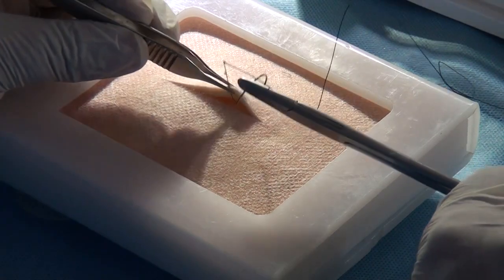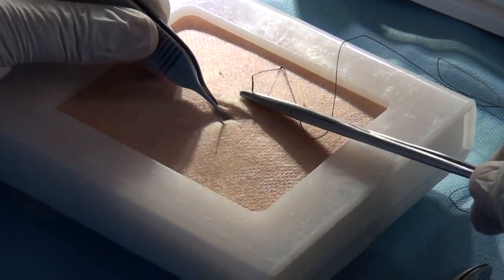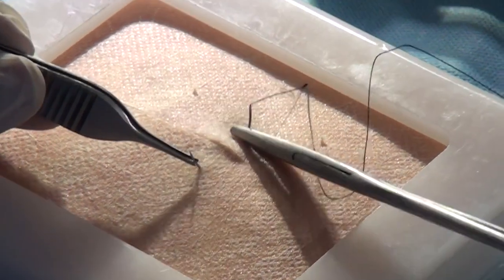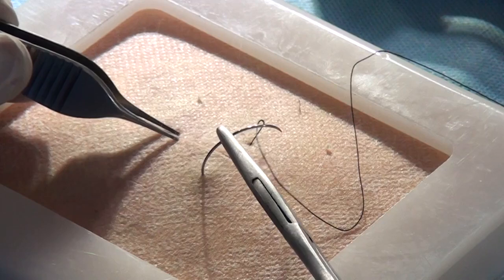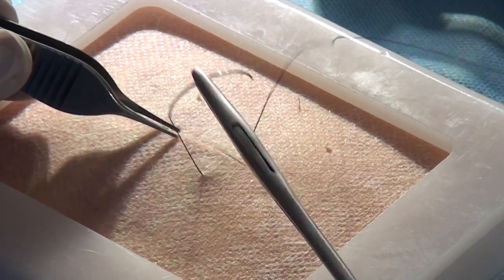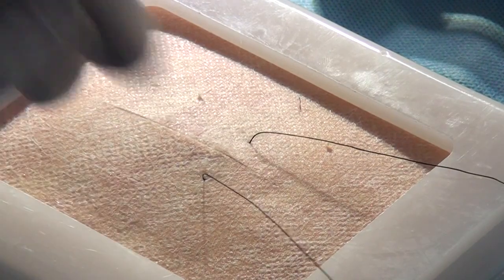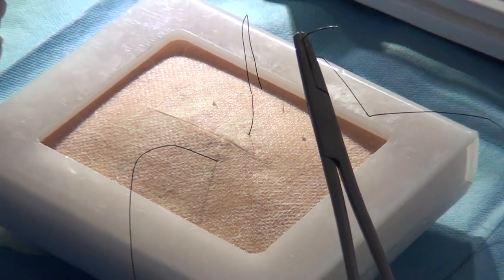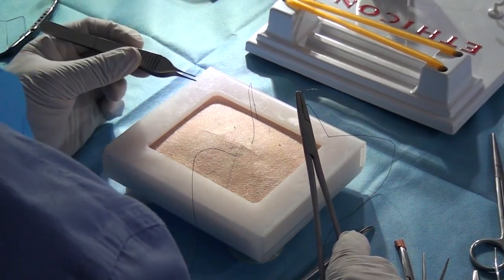Now I'm taking a bite, watch it, and I glide through the tissue, and I use my counter forceps to come out to the other side. And remember, I have held it on the other side. I'll rotate like this. No pulling. And remember, the safest place for the needle to be is on the needle holder. You can note it now. Safest place for the needle to be is on the needle holder.